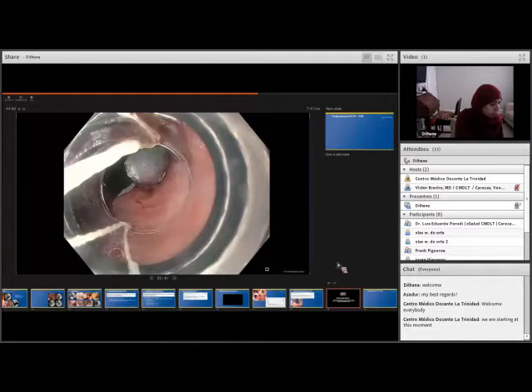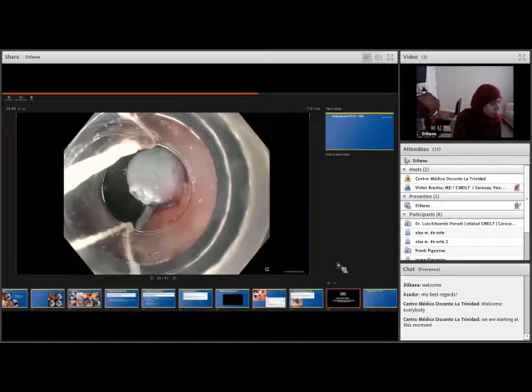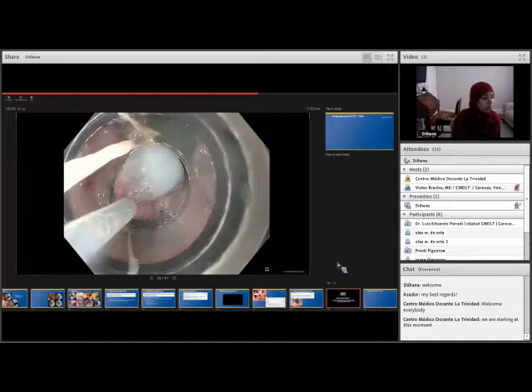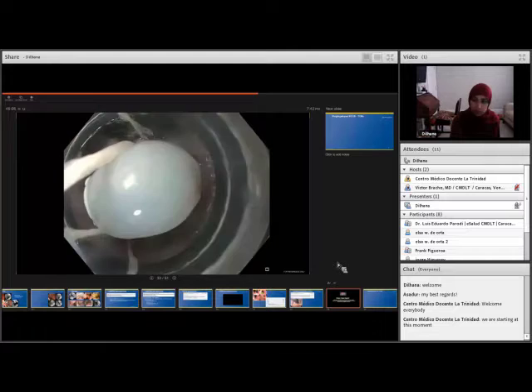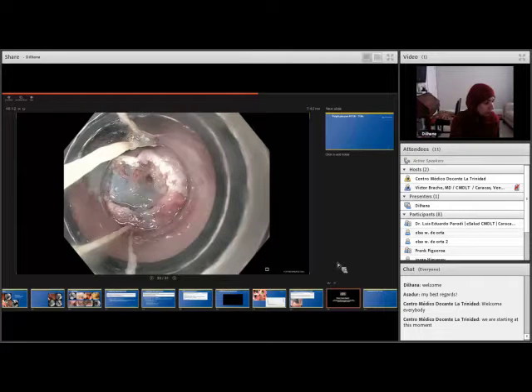The area immediately adjacent to the prior resection site is targeted. In this case, the second EMR was also performed with the band EMR device and ultimately was removed with the snare. We were concerned that we included a portion of the prior resection site, as seen on the left portion of the banded tissue, and we thus opted to perform the resection over the band.